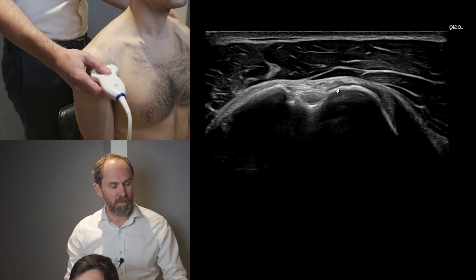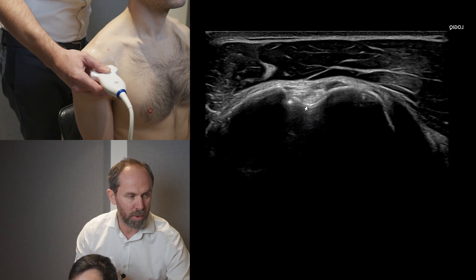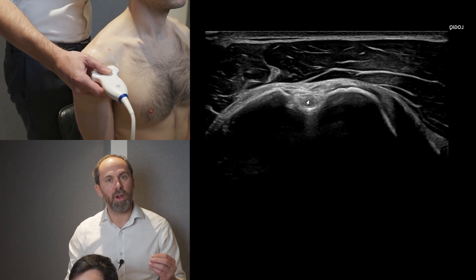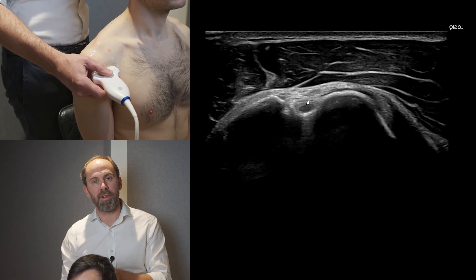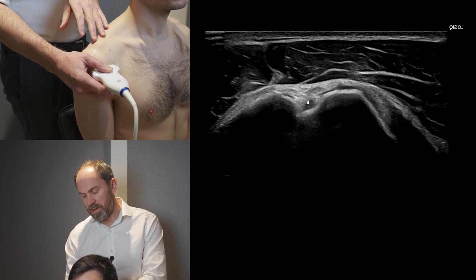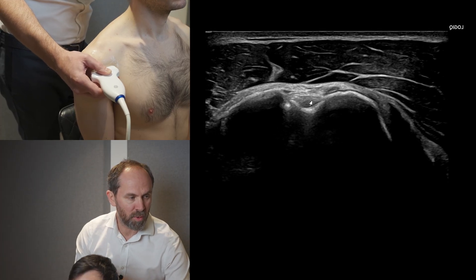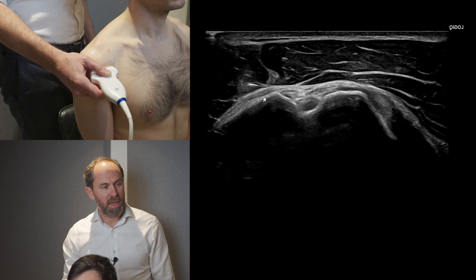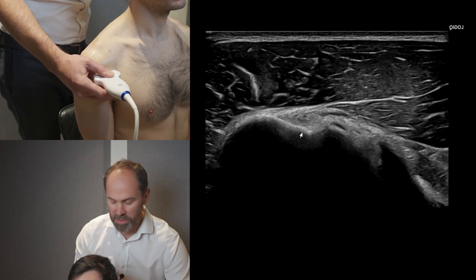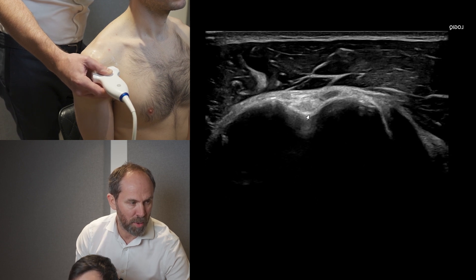When doing a transverse image of the biceps, you can see it goes dark when the bone isn't bright enough — tilt the probe and the bone goes bright, and you can see the long head of biceps sitting within the groove. We then follow that biceps slowly down towards the pectoralis major insertion, which is on the inferior aspect of the bicipital groove on the humerus. As we do that, we need to tilt and heel-and-toe to keep the bone bright and the tuberosities level. Remember, on top of the biceps we have the transverse ligament.